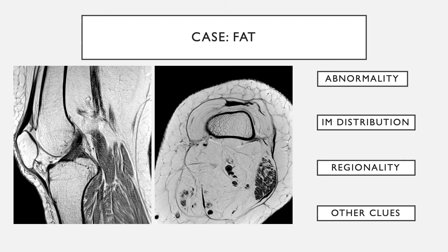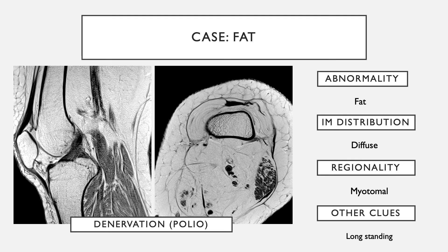In another case, the lower thigh musculature is completely fatty infiltrated with no muscle remaining — just tendon. The calf musculature looks intact. This is diffuse fatty infiltration involving a particular myotomal segment — the lower thigh — that has been longstanding. This is an example of denervation from poliomyelitis.